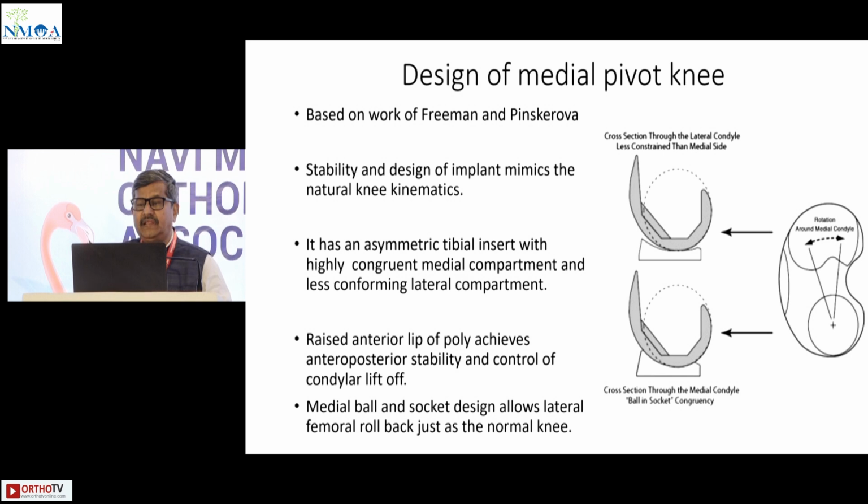Now, the design of the medial pivot knee was based on the work of Freeman and Pinskerova, who is a lady from Hungary. Stability and design of the implant mimic the natural knee kinematics. It has an asymmetric tibial insert with a highly congruent medial compartment and less conforming lateral compartment.